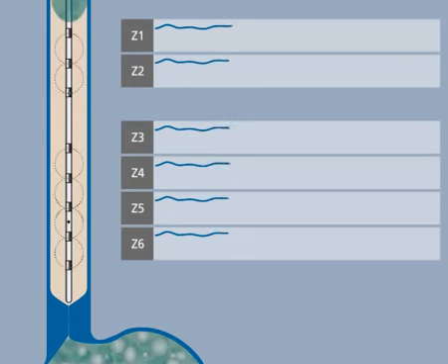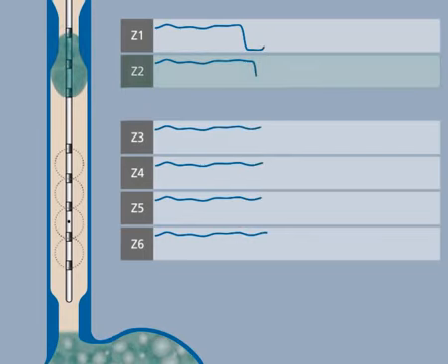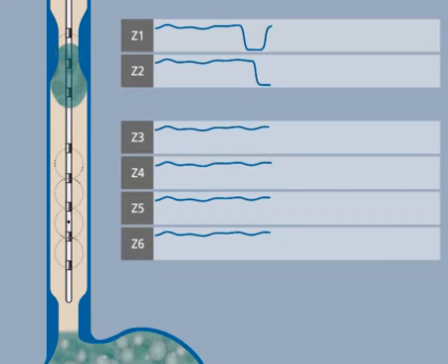First, the liquid bolus will pass channel 1. The impedance drops on that channel. The liquid bolus moves and reaches channel 2. The signal of channel 1 returns to the baseline, and on channel 2, the impedance drops.